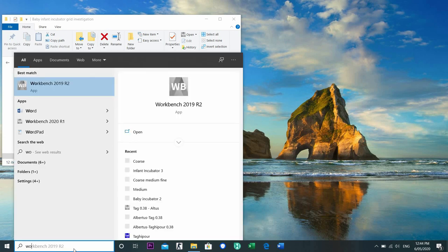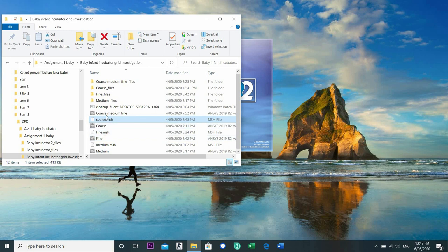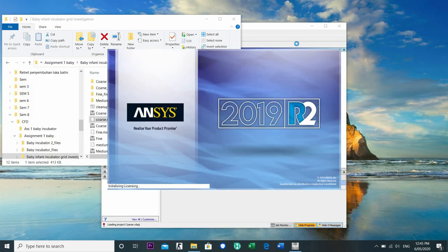I've exported the mesh before, so the way to export it is like this. I have exported the coarse mesh only to the coarse.msh like this, from that design into the msh folder, so it can be inputted into another workbench if there are mistakes. So I will show you how to export it. Export the mesh into the .msh, so you can go to the workbench and get a better condition for simulation.